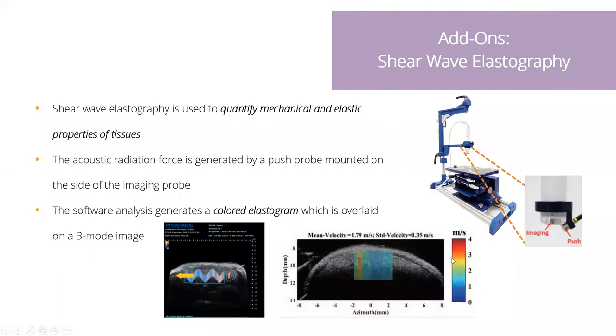In tissues that are developing disease like fibrosis, which may be a more homogeneous change within the liver, we're going to see a global change across the liver parenchyma. If you have, for example, a lesion or a tumor starting to develop, it'll be much more of a focal lesion that we're able to identify.